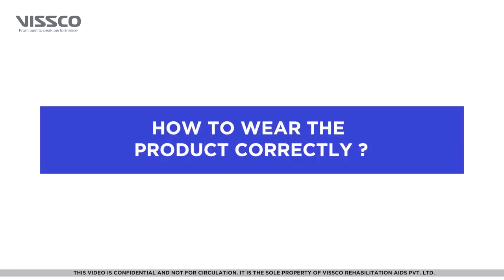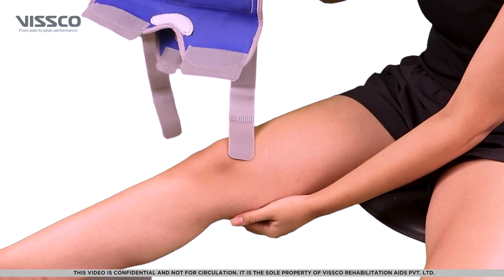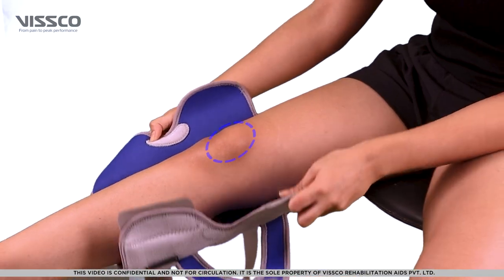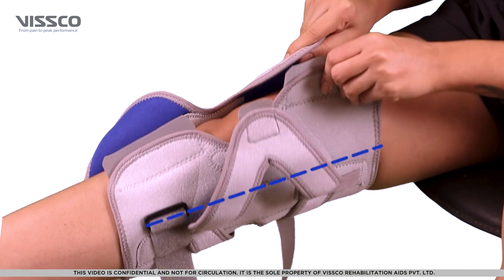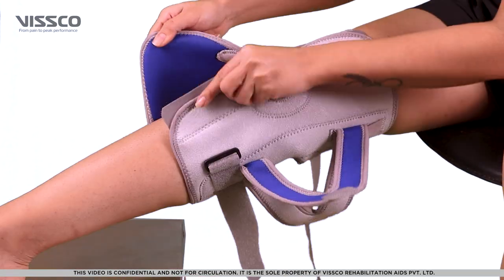Now that you have selected the right size, let us wear the product. We are using this product for a right varus deformity, so the hinge is on the inner side of the knee. Place the brace over your knee so that the opening on it comes over the patella. Make sure the hinge is on the inner side of the knee. For varus deformity correction, fix the brace with the middle velcro.